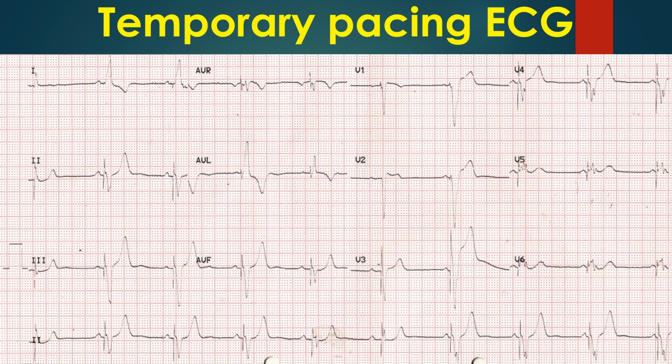In analog ECGs, the pacing spikes in temporary pacing are usually small as the pacing is bipolar with both electrodes within the ventricle. In digital ECGs, such small spikes are usually wiped out by the filter settings and the ECG appears like a left bundle branch block pattern. But switching on the pacing detection algorithm in digital electrocardiographs enhances the pacing spike detection, and sometimes the spikes are prominent even with temporary bipolar pacing, as in this case.